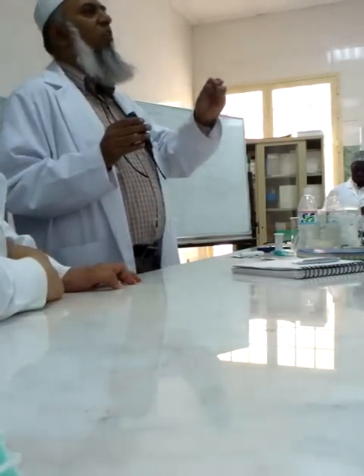Why not before the exercise? The instrument is giving value. You can say that if the instrument is not working properly, it means the 522 value was wrong. Maybe it is 300, not 500.